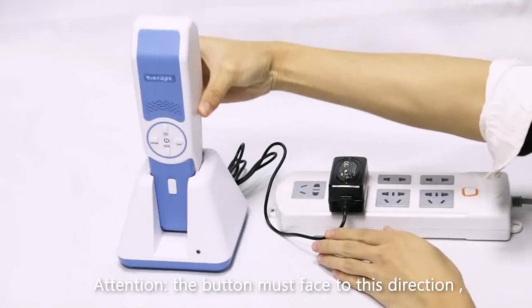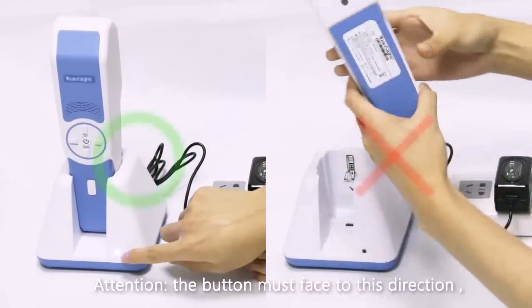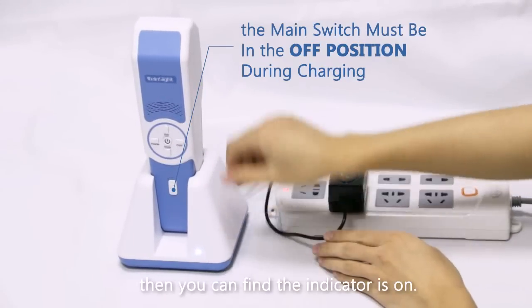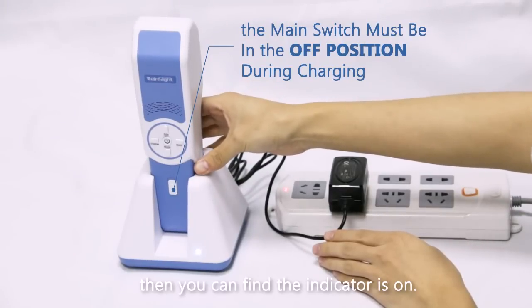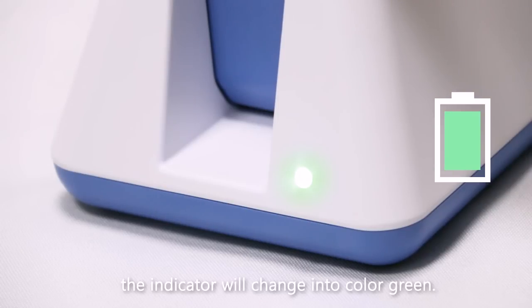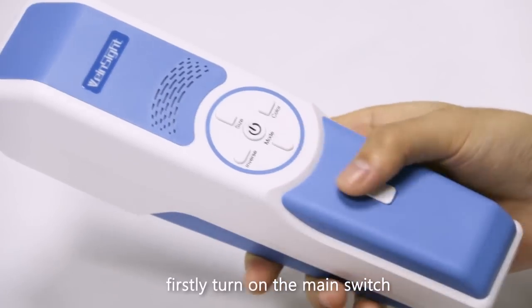Then put the imaging unit into the charging cradle. Attention: the button must face this direction. You can find the indicator is on when the battery is charging. When the battery is fully charged, the indicator will change to green.